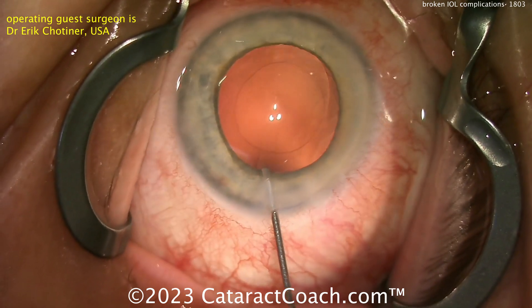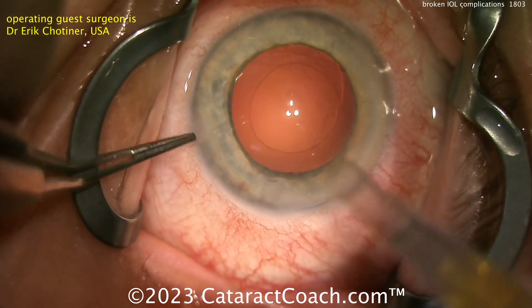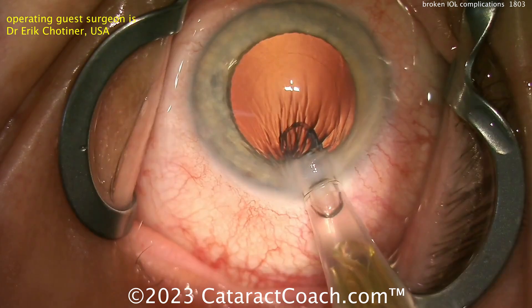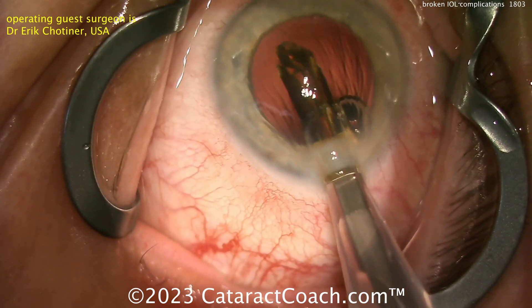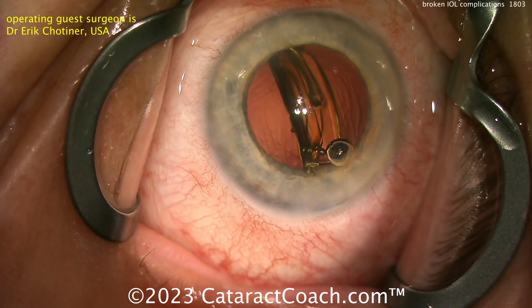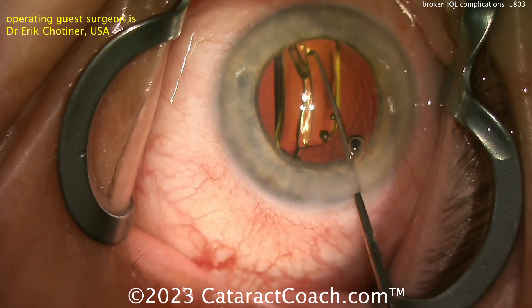Here's a routine case from a very experienced cataract surgeon. A routine case, nice capsular bag, everything looks normal. Going to implant a single-piece acrylic lens in the capsular bag. This is the surgeon implanting the new Alcon Clarion lens where his technician has loaded the lens for him. Lens goes in the capsular bag, looks pretty routine, right? Get that lens delivered — we've all done this before.